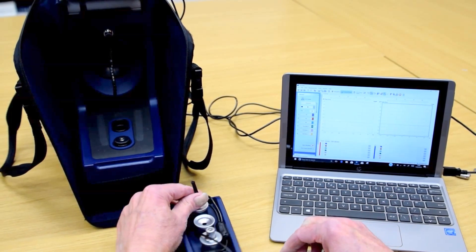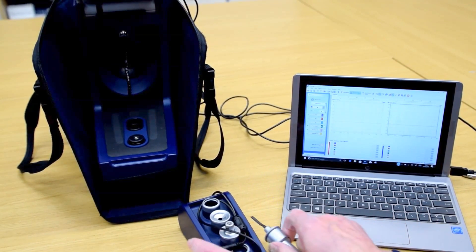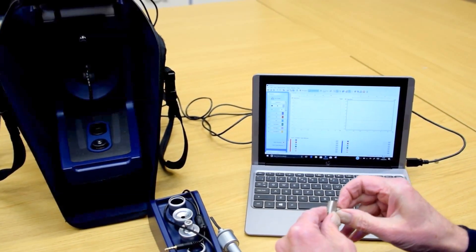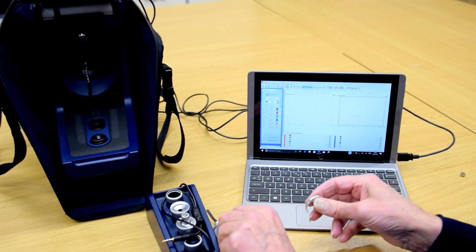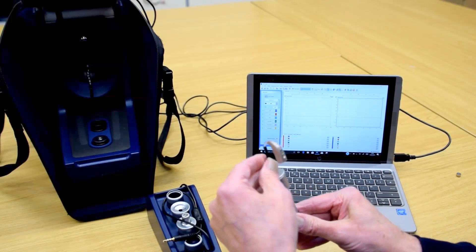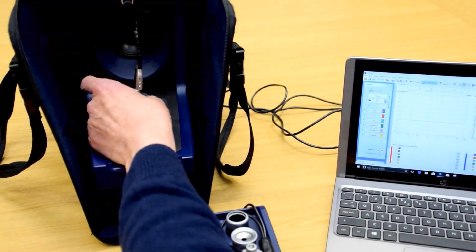We're going to be testing the BTE hearing aid, so you need the BTE adapter. This is the hearing aid I'm going to be testing — put a new battery in before you start the test. This is an Oticon Spirit Synergy. That goes on the end of the black tube and into the front slot in the chamber with the reference microphone directly above. Close the lid.